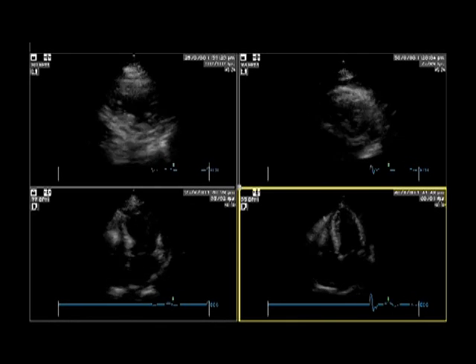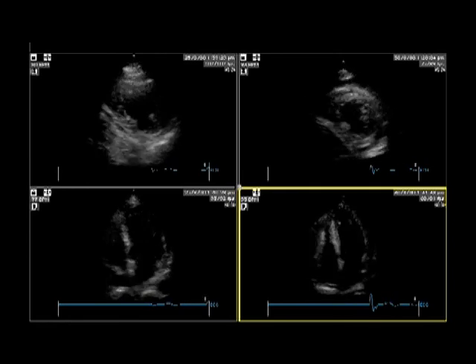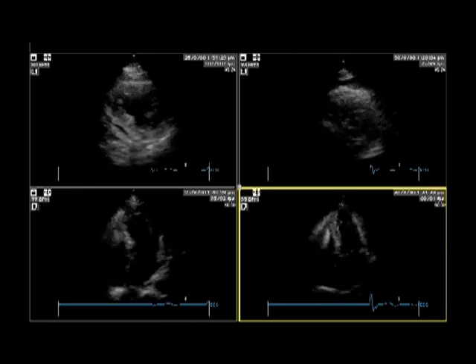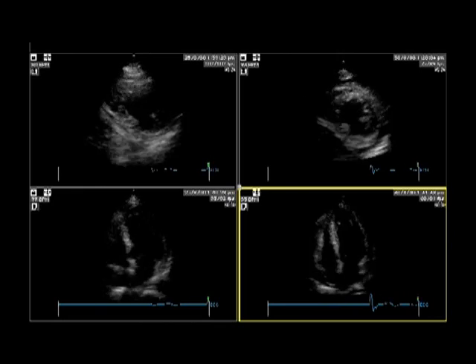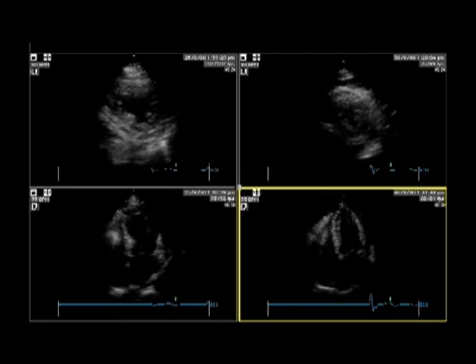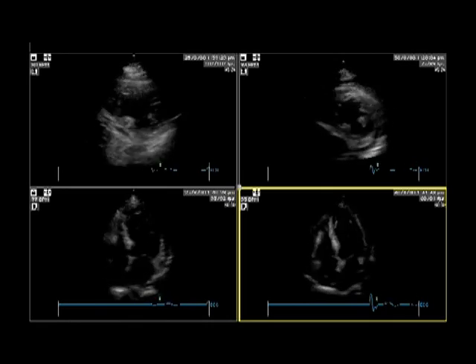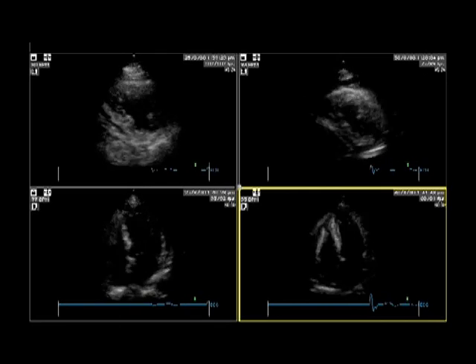The acute transthoracic echocardiogram is on the left, and 3-month follow-up is on the right. The acute study shows akinesis of the anterior septum, anterior wall, and apex. The follow-up study shows that there has been a recovery and normalization of the systolic function.